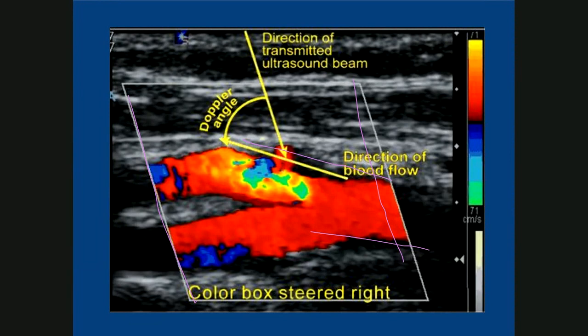with that same angle. And this time we have to line up our angle correct with the vessel wall so it's parallel, and that should be at 60 degrees. So that's the next thing you're going to be practicing, is lining up.